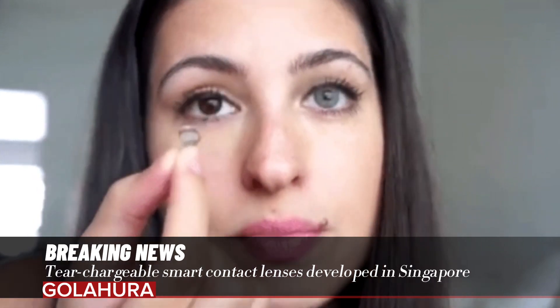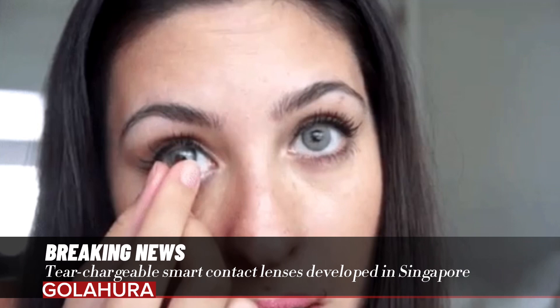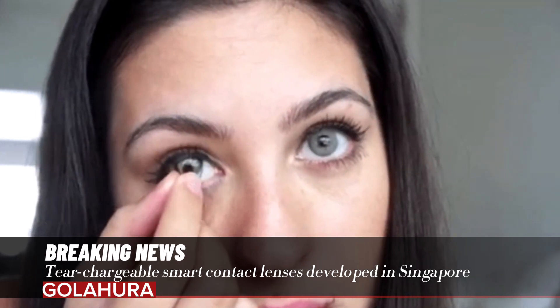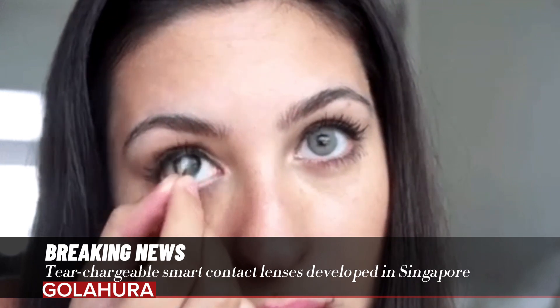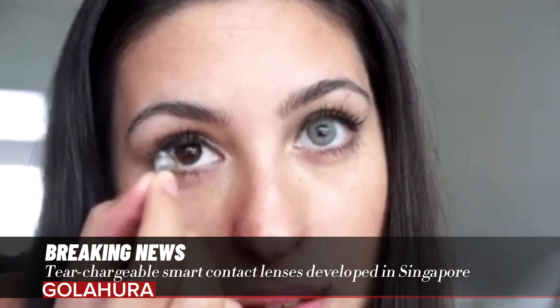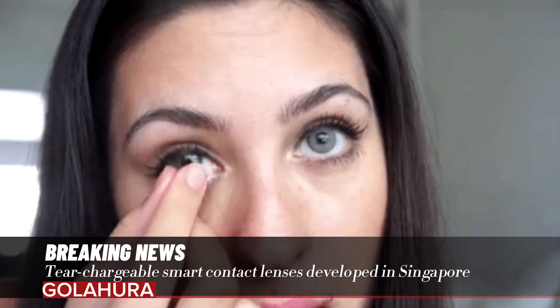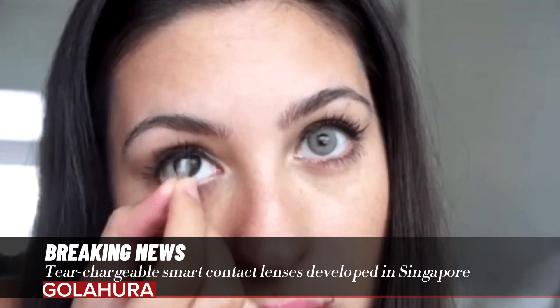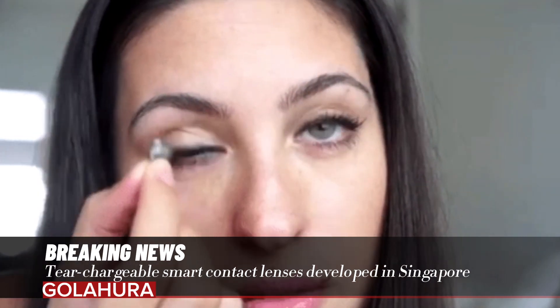While wireless power transmission and supercapacitors provide high power, their integration poses a significant challenge due to the limited space in the lenses. By combining the battery and biofuel cell in one component, the battery can recharge itself without needing additional space. The electrodes placed on the outside of the contact lens also ensure that the vision of the eye is not obstructed.